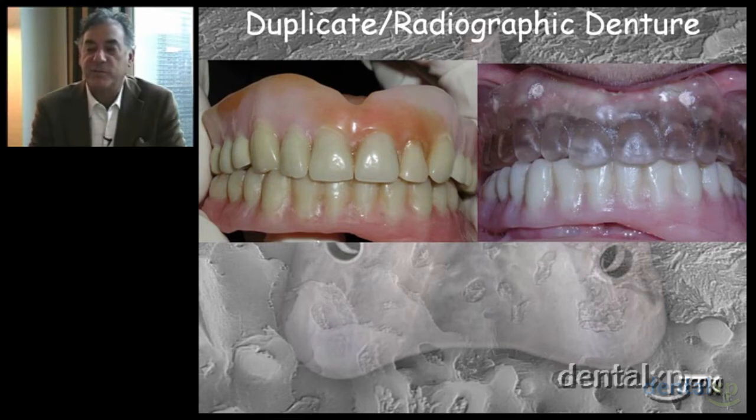In a full denture case, you can place the gutta-percha points. The computer will look for a matching set of 4. However, we recommend putting in between 10 and 12. That would allow for no problem in getting the 4 minimum as a match. The gutta-percha points are approximately a number 6 or number 8 round burr in circumference and in depth.